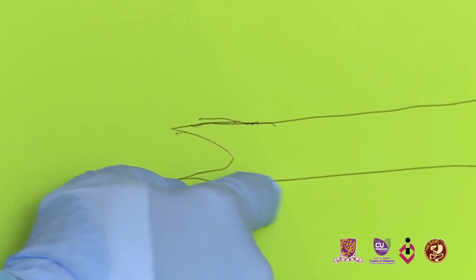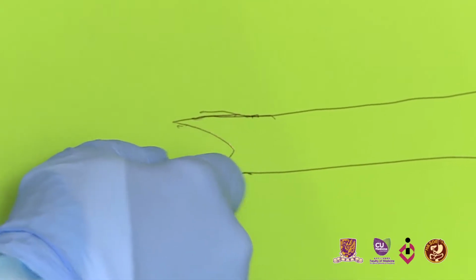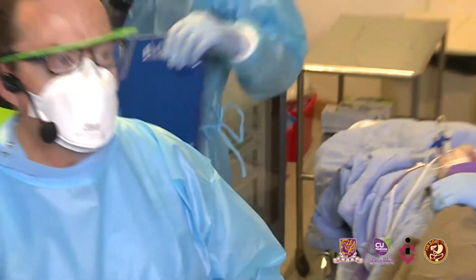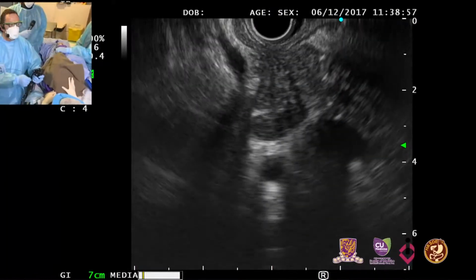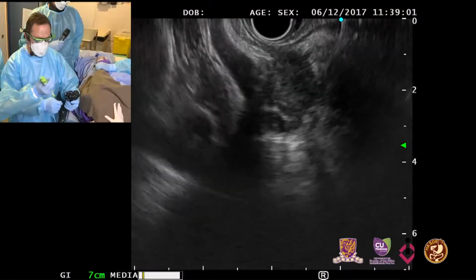Imagine it has 2 spikes. So these are cutting spikes. The thinking is that that design of the tip will help you acquire more tissue. That's the difference from conventional needles in the market.